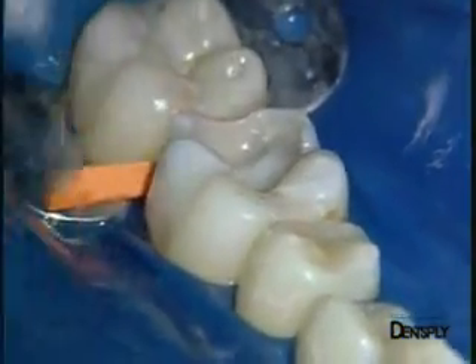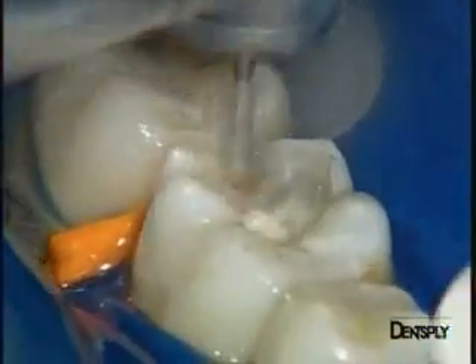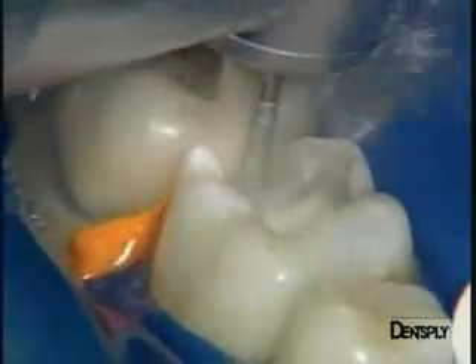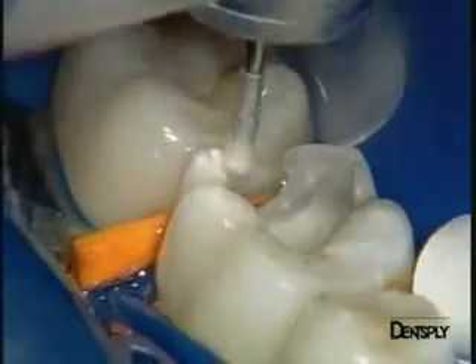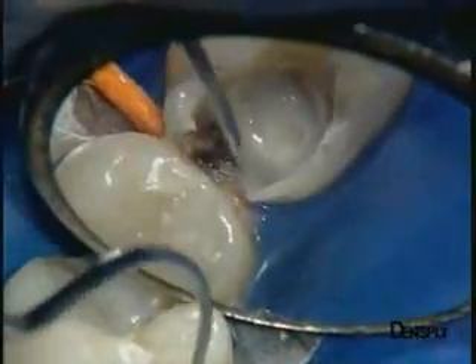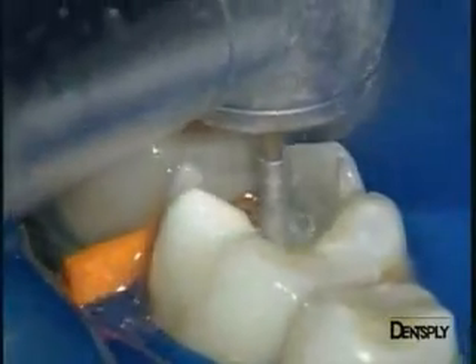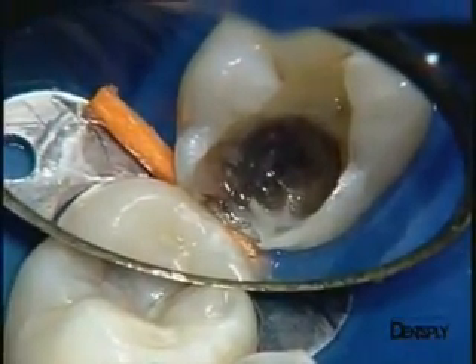A wooden wedge is positioned in the distal interproximal space to both protect the clinical field and create a gap that will avoid damaging the neighbouring tooth. The whole of the composite is removed at the proximal face. There is still some old composite in the deep part of the restoration, and we can see secondary decay at the cervical level. The residual composite is removed and it becomes clear how voluminous this restoration is and how fragile the distolingual wall is.